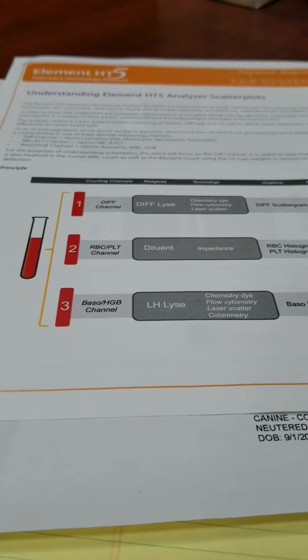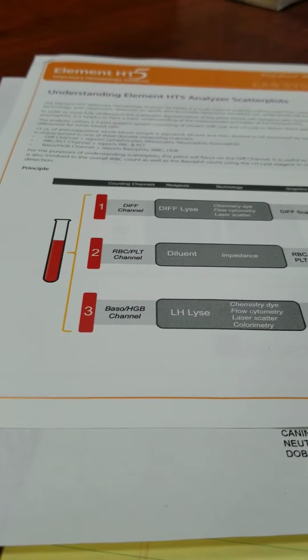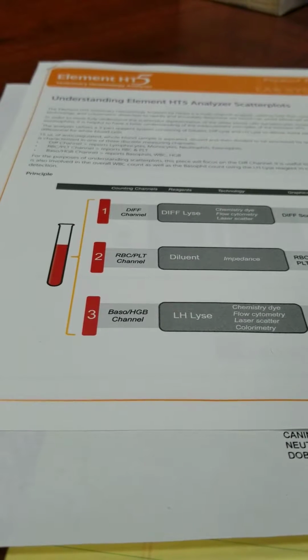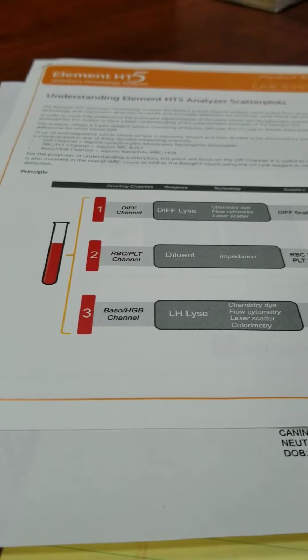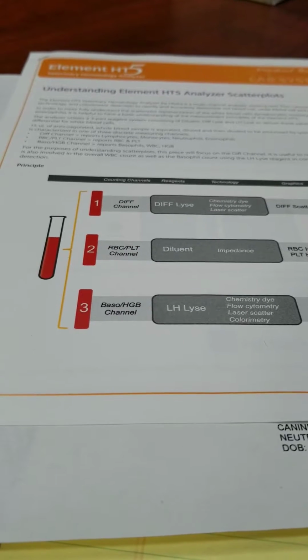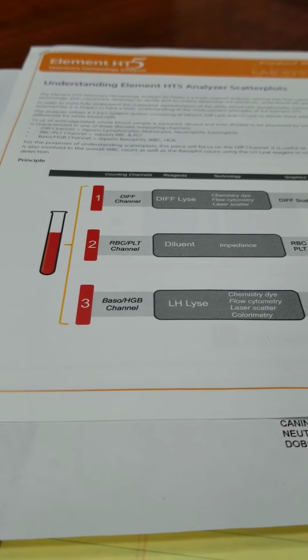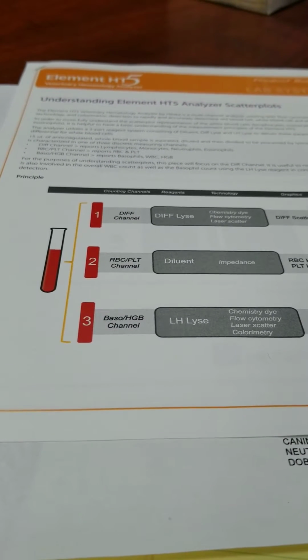So that's pretty much troubleshooting with the HT5. If you find anything else that you're having questions with, like the results are just not making sense no matter what you're doing, and you're not seeing an issue on the blood smear, call tech support. Their number's on the front left corner of the analyzers. It's 1-800-GO-HESKA, option 3. If it's after hours, always choose the page option. Don't ever leave a message, and they will get back to you immediately. Okay. Great.